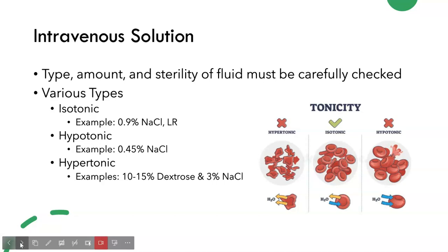But there are different types of IV solutions. This is considered a medication. It's ordered by the doctor. So the doctor will decide which solution the patient is going to be getting. But it's important to know the effects of the different solutions and how to give them safely. So it's important to note the type, the amount, and the sterility of the fluid. So the type, we're going to talk about some different types.